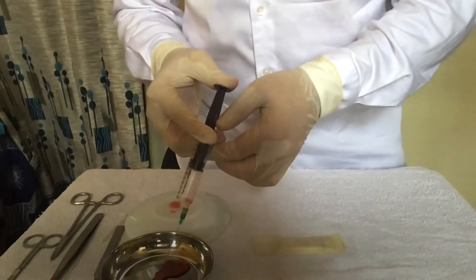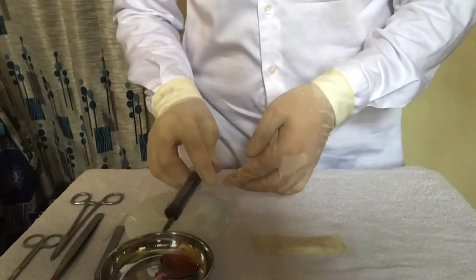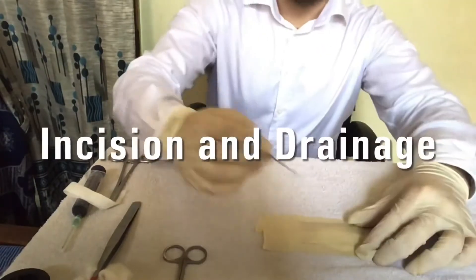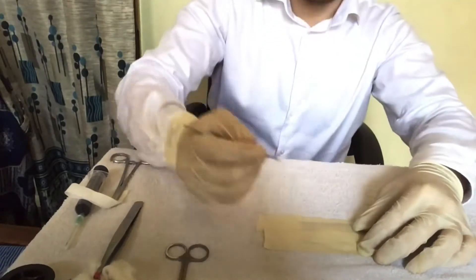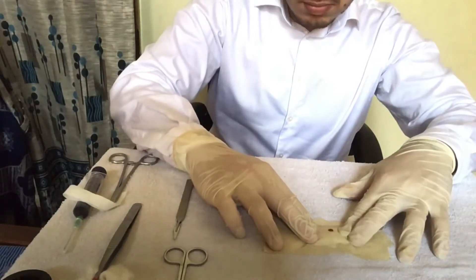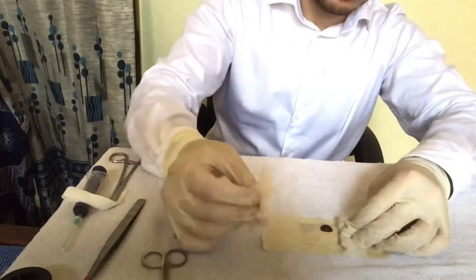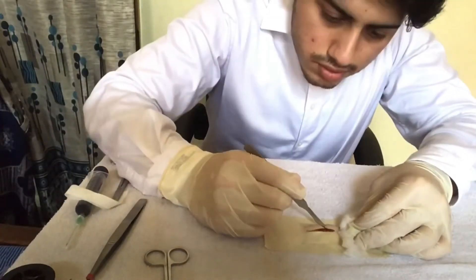For incision and drainage, prepare the site and use blade 10 for making an incision. Make an incision gently and press firmly to squeeze out the pus. Use cotton and gauze to squeeze out the pus and clean the site. Try to squeeze out all the pus.